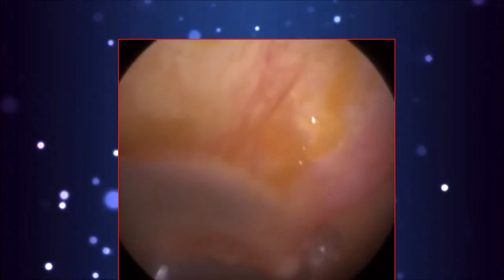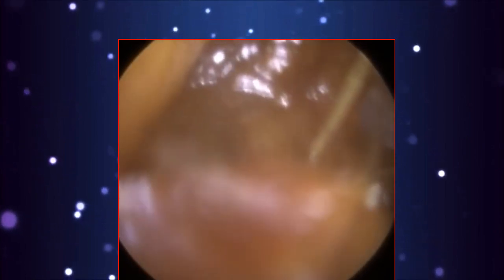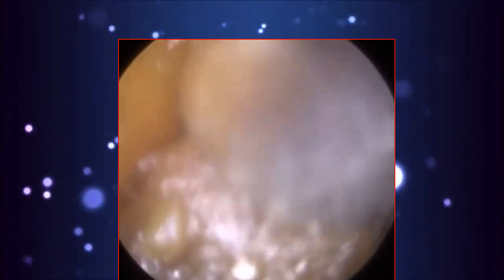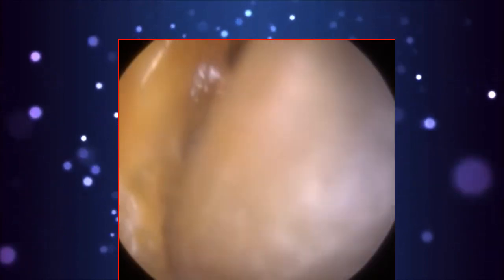So it's just a bit of wet sticky wax on the anterior canal wall. Just remove that. Patient's eardrum's otherwise intact and healthy. Just moving on to the right ear now. Similarly to the left ear, it's very sticky glutinous wax, and it extends all the way from the entrance to the eardrum, so medially. It's got this mashed potato consistency.